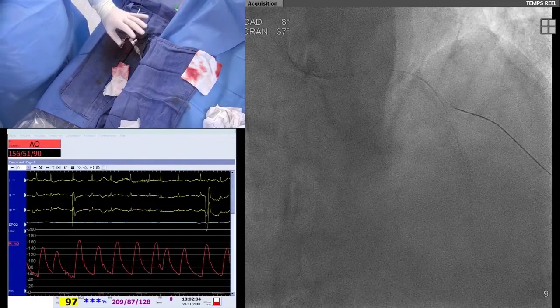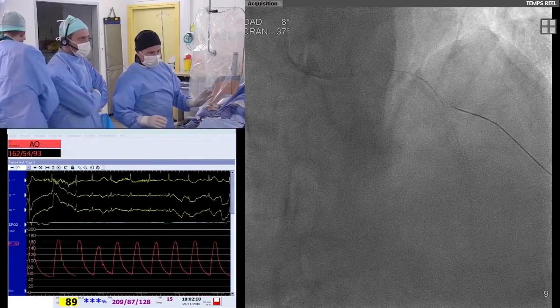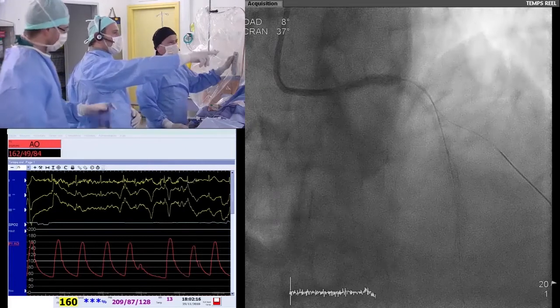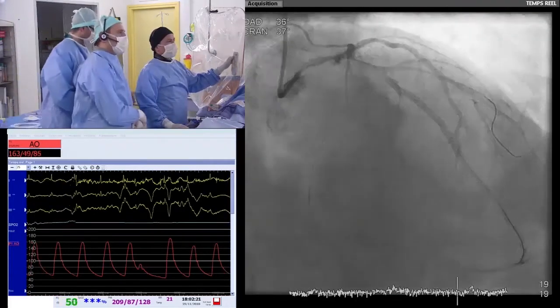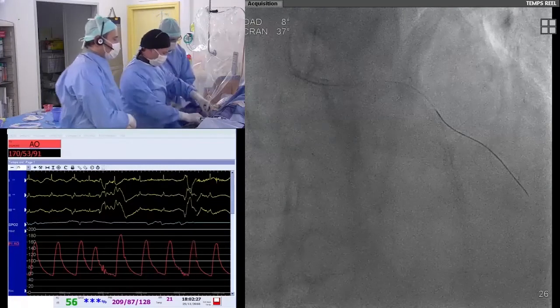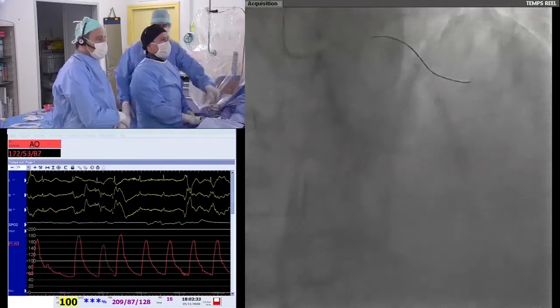Yeah. And if you have enough time, we can assess the length with an IVUS. I think do what you would normally do. Yeah, I won't do an IVUS. You know what? This radiopaque part of the wire there in the diagonal, how long is that one, Nicola? It's about 4 centimeters, that one. We could just pull back that one a little bit, and with that assess the length of the proximal stent. Yeah, like this.